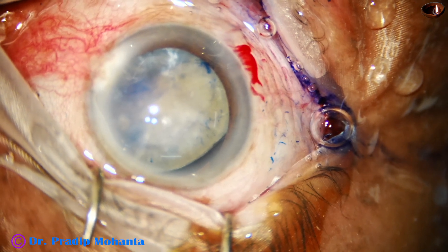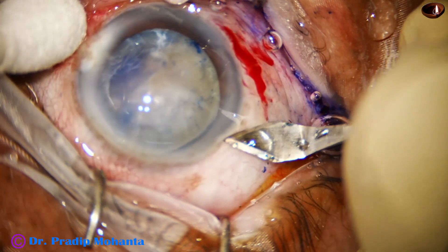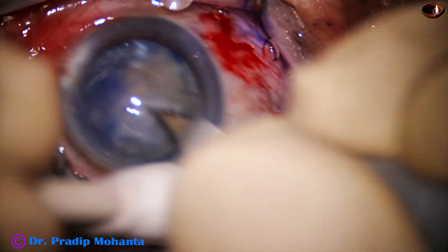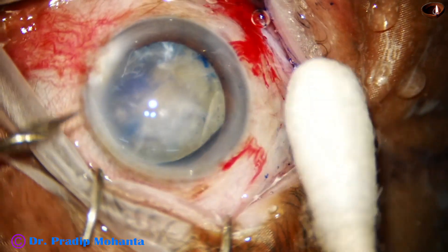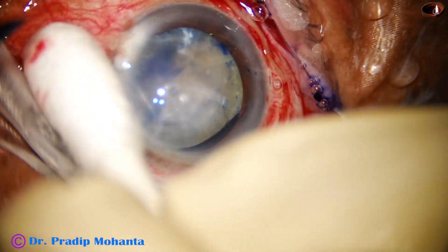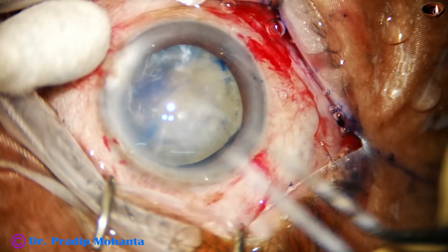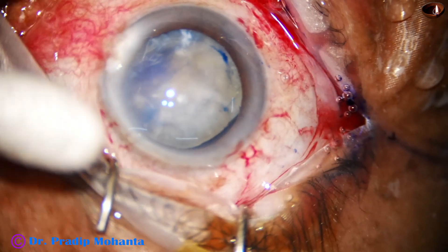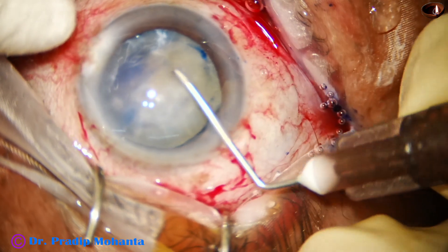The staining is not good. Let us see how to proceed. This is the main incision with a 2.8 mm steel keratome on the posterior aspect of the limbus. The anterior chamber is filled up with visco. This is a sideport on the left side of the main incision. And now I'm trying to do capsulorhexis.